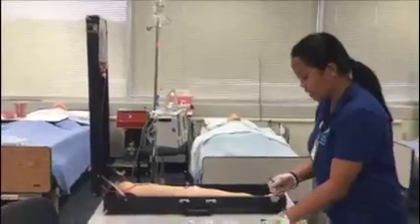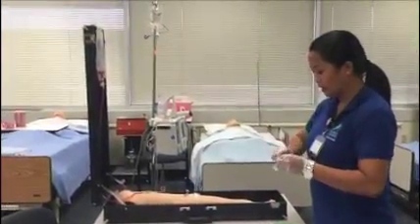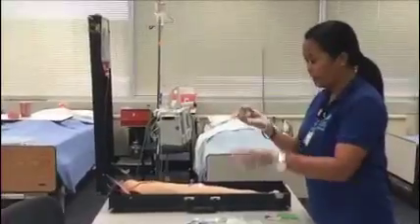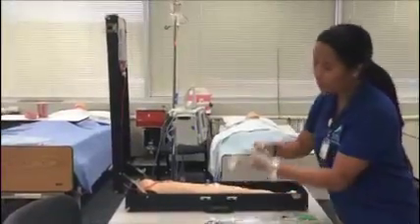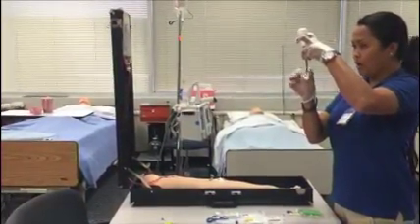I'm going to take the blunt needle, put it in, and inject 0.5 air. I'm going to stab it, flush the air, and then take 0.5 medicine.